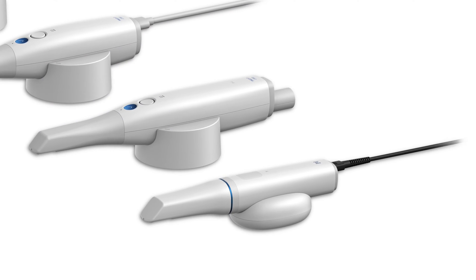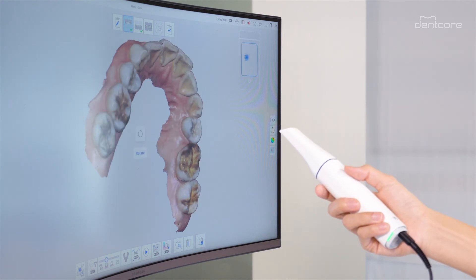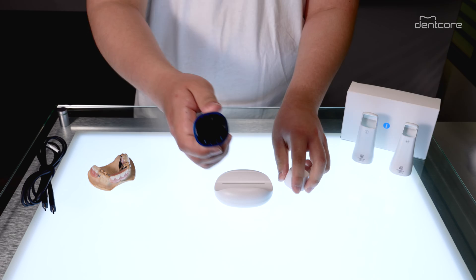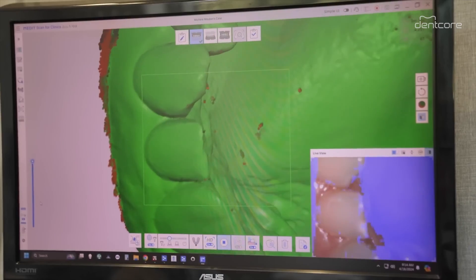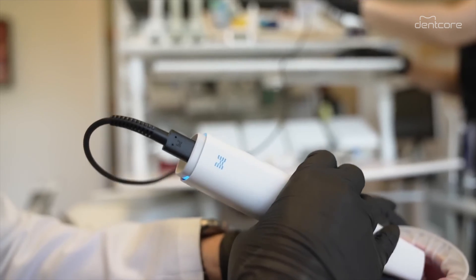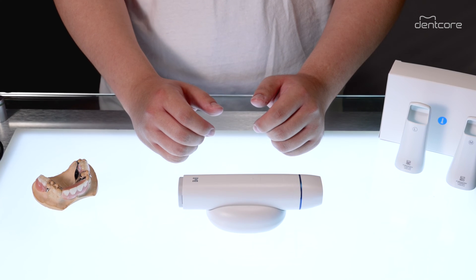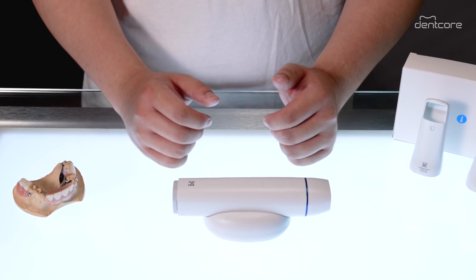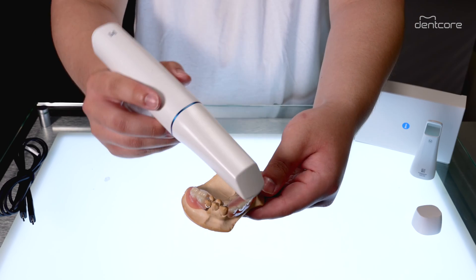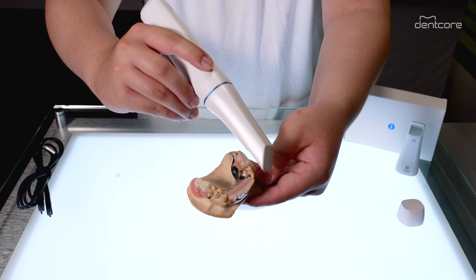The Medit i900 is the company's fourth intraoral scanner and it's built with their third generation new optical engine, providing 64 times richer color than its predecessor and delivering images of unparalleled clarity. It also has a deeper scanning depth of 30 millimeters versus the i700's 21 millimeters, and you can now effortlessly scan highly reflective metal surfaces with ease.